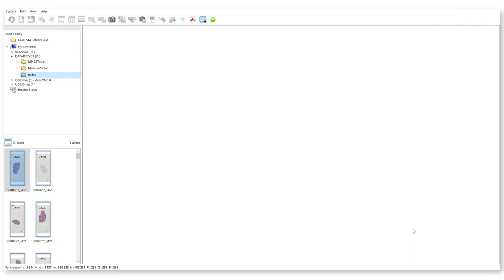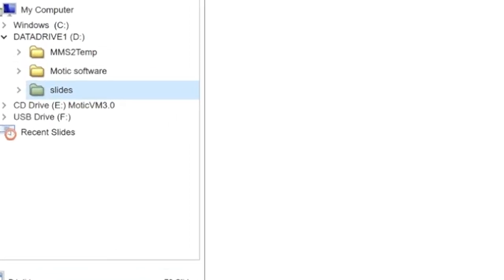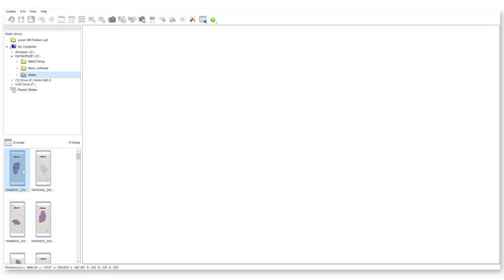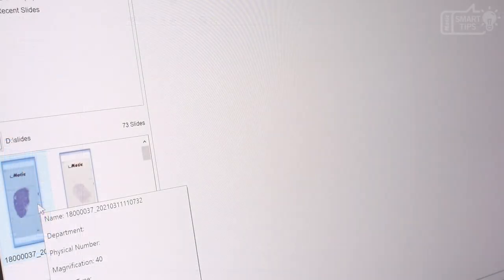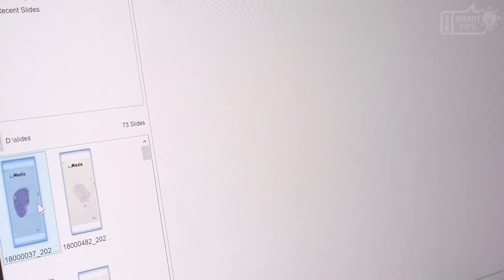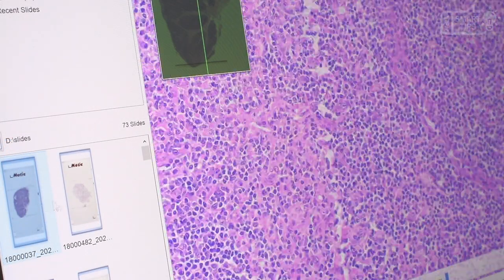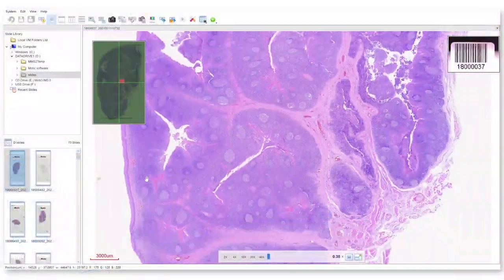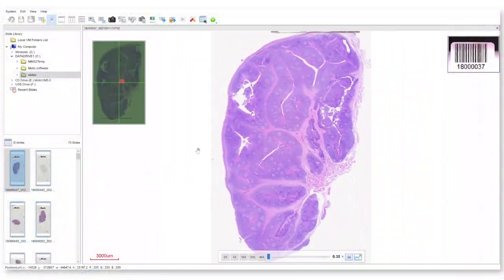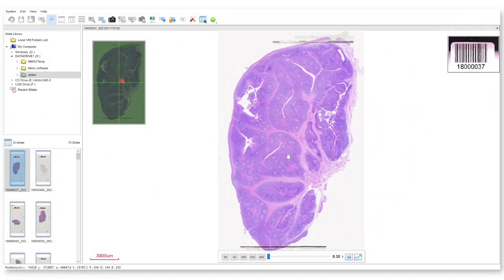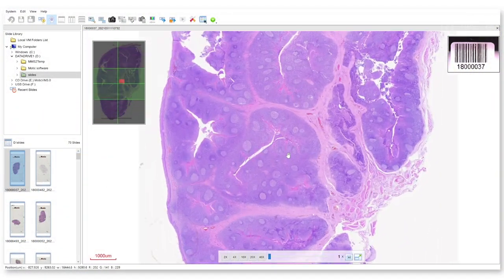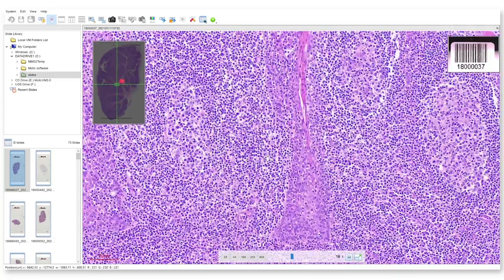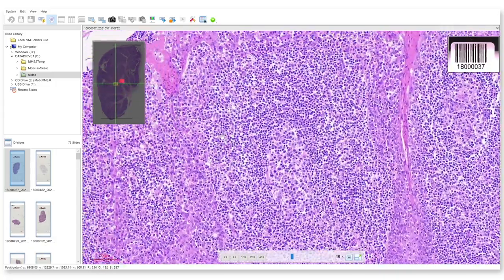Okay, so once you have finished scanning or just want to open the slides that have been scanned, just go to Motic Digital Slide Assistant, select the folder where the slides are and double click on anyone that you want to open. In this case, I will open the last one that has been scanned. It'll load. And this is the final result. As you can see, the image quality is great.